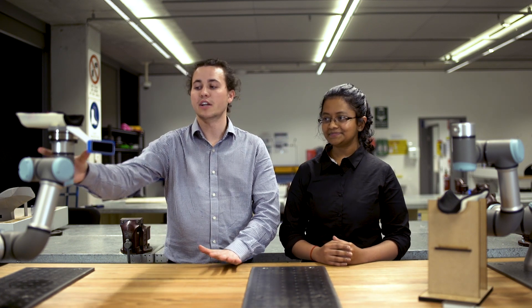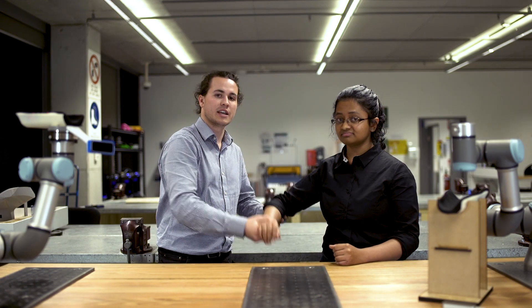Our first product today is Universal Care. Universal Care is my first prototype. I started working on it after my nan had a stroke at the end of last year. Watching me go through this process was difficult and I realized there are actually a few things wrong in the process. Typically what physiotherapists do currently is manhandle patients, physically repeating the same exercise over and over again. Now this is actually causing themselves injury — 67% of physiotherapists get injured in their line of work.